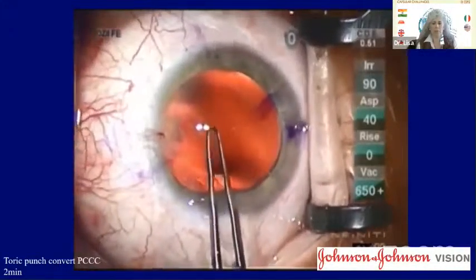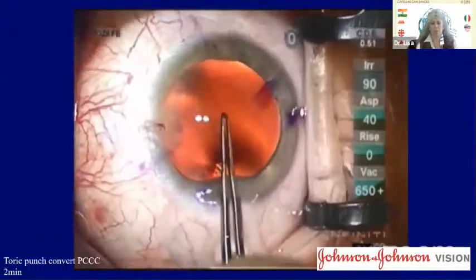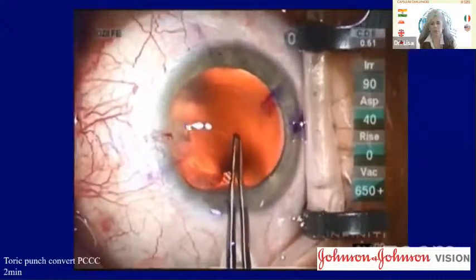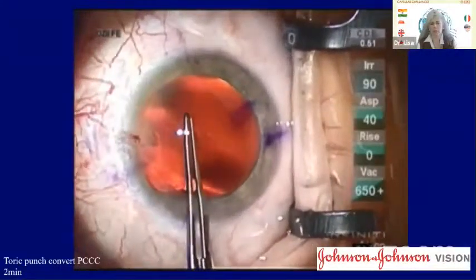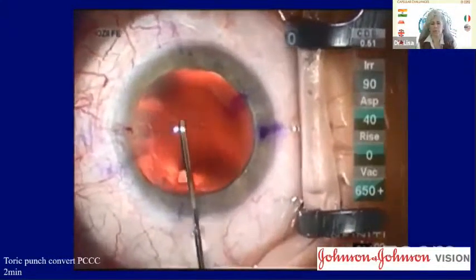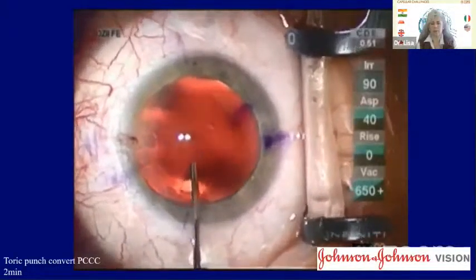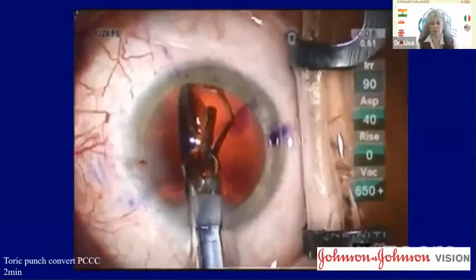That's much more difficult in the face of a ruptured anterior hyaloid, but fortunately we kept the chamber from collapsing on removing both the phaco and I/A tips, and so the hyaloid never broke in this case, permitting us to go on with a completely uncomplicated case. Now that we've accomplished that, we can fill the bag and feel safe to place our toric implant. Pressure on that posterior capsule will not extend the tear because we have a true rhexis.